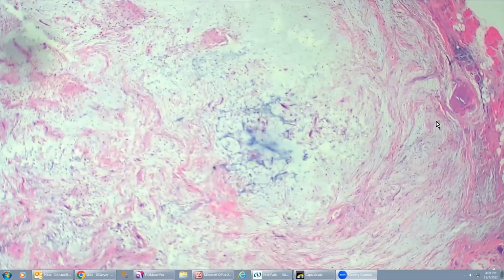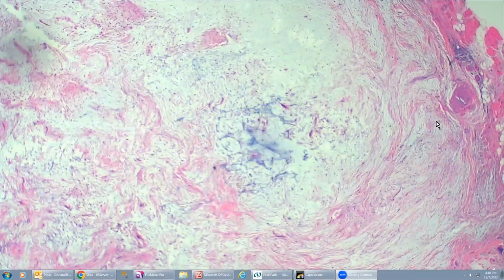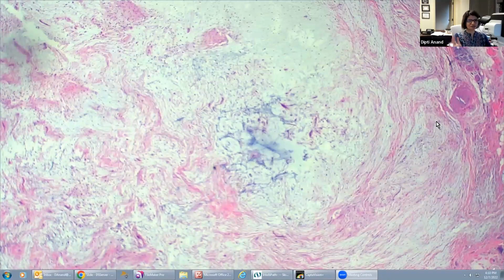So yes, Katie confirmed you can get myxomas in Carney complex. But is a myxoma the same thing as focal cutaneous mucinosis? It's not the same. They are different entities, but the histology can be very similar, and often we use overlapping, synonymous terms based upon the clinical presentation. Focal cutaneous mucinosis most often presents as a clinical nevus versus BCC: a tiny papule with lots of mucin. A myxoma is also a solitary lesion, but they tend to be bigger. And a subtle difference between the two is that myxomas look more like a tumor.